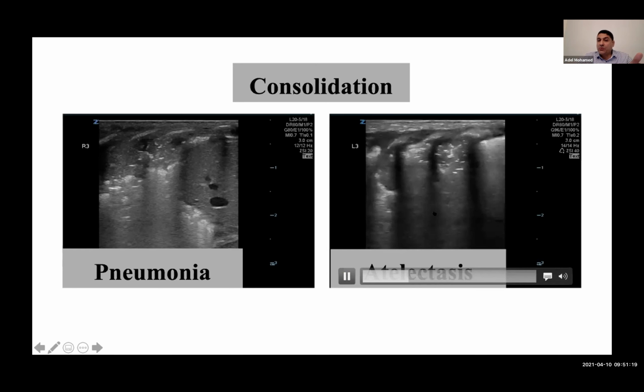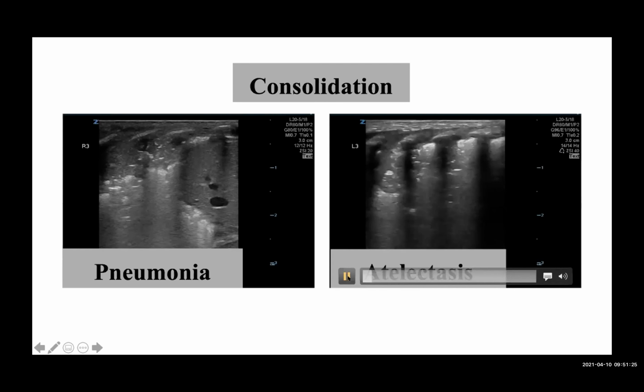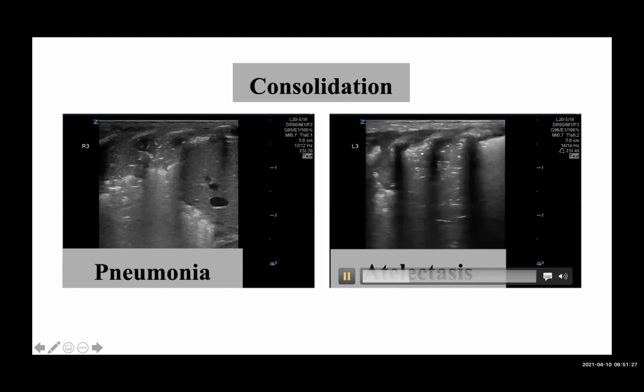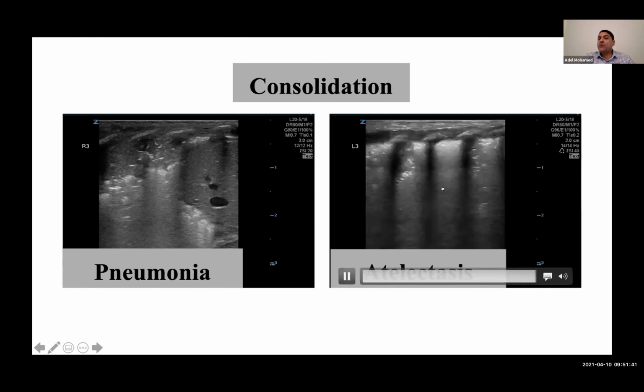So you see it between, you see it become more dots, you see it in between. See, like in this one, here and here. And if you focus on this part of the lung, in a second, it will be whitish, meaning all this atelectasis opened up. And this is usually during the inspiration. So this goes more with atelectasis. Pneumonia will not open and close, okay?